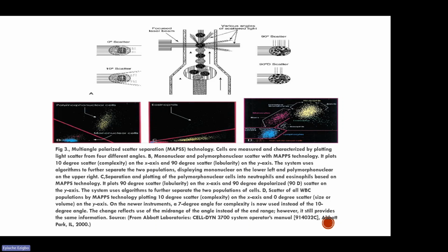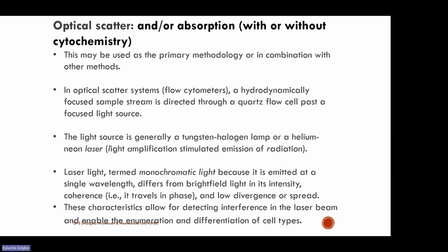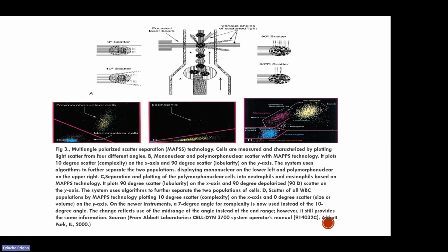The ones that are being reflected or refracted, or at this angle, they also pick up as a different population, and using what do they call it? Using cytochemistry, some staining, they'll be able to also differentiate. Is cytochemistry, when they add staining, able to differentiate this population of cells. You can see that these ones that diffracted are actually the same because they almost stain the same.